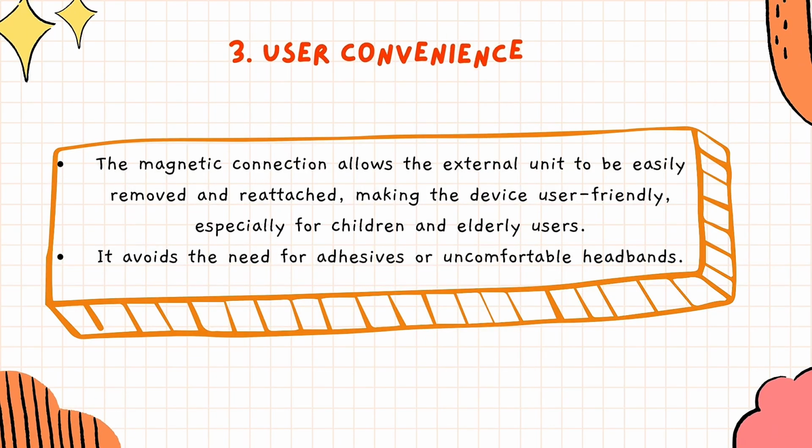For the last one is user convenience. The magnetic connection allows the external unit to be easily removed and reattached, making the device user-friendly, especially for children and elderly users. It avoids the need for adhesives or uncomfortable headbands.